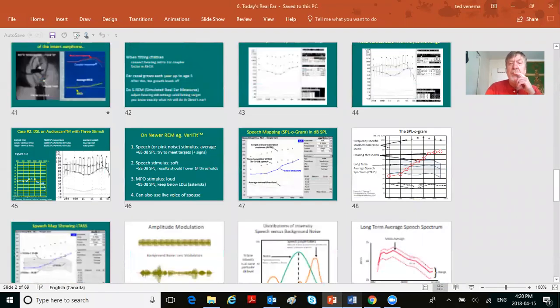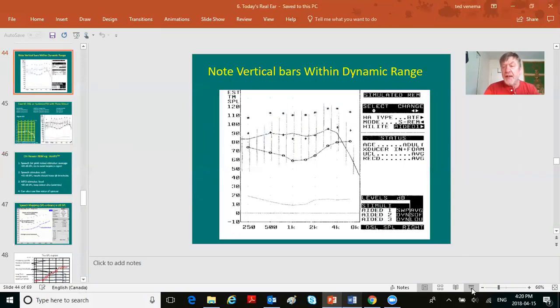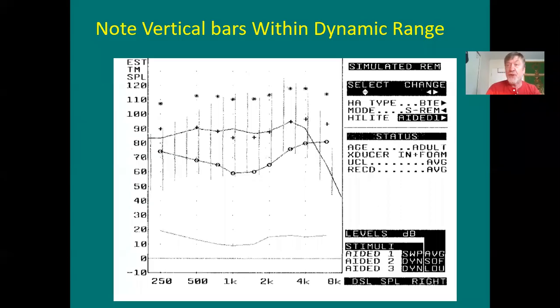We'll go back to our picture here and move on down. Okay, so now you are here. What that machine did was first it had average inputs, and then you'd match your targets for average speech inputs, and then you'd have soft sounds coming out like bleep, bloop, bloop, bleep, and it was meant to imitate the stops and starts of speech. They didn't have actual speech. It was just sounds that imitated the staccato stops and starts of speech.